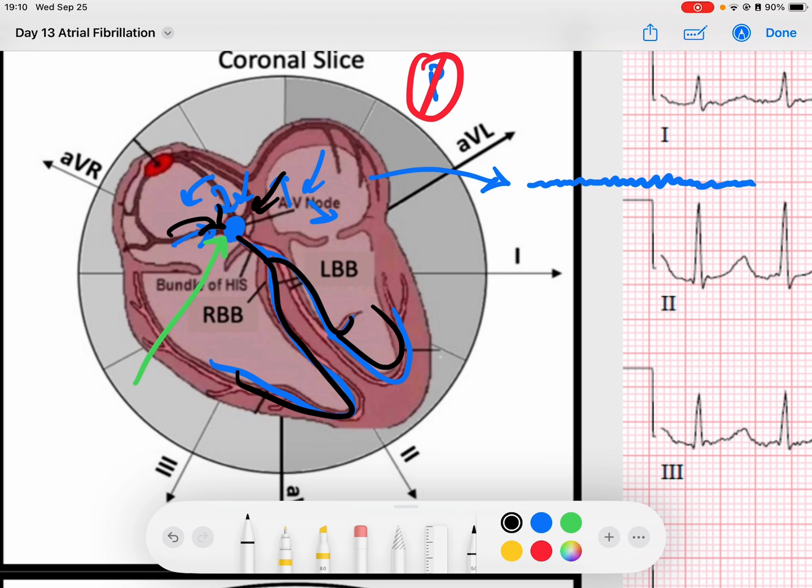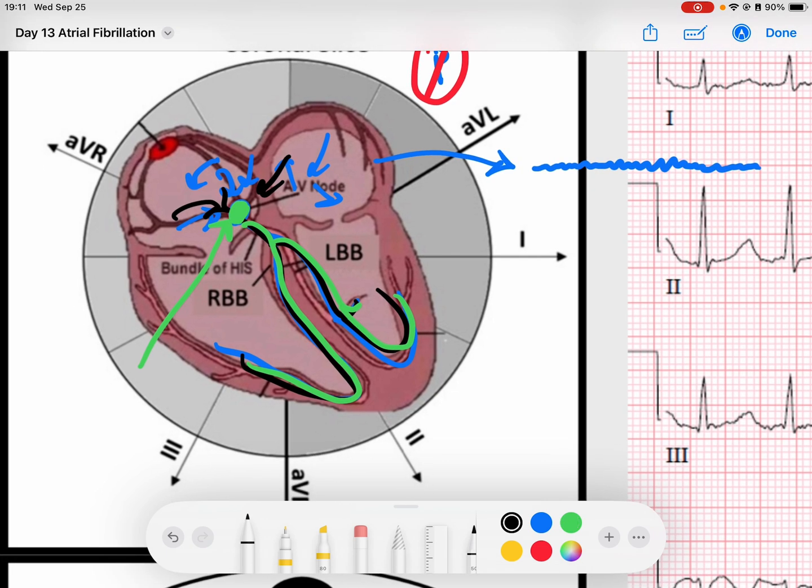What ends up happening is that the QRS complex, which we know is generated when this AV node captures the signal and sends it down, those QRS complexes are generated when the AV node recovers from the previous beat. The AV node is going to recover from the previous beat in an unpredictable pattern. So what ends up happening is you get somewhat random conduction.